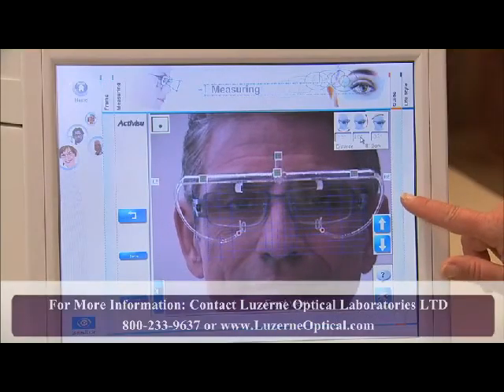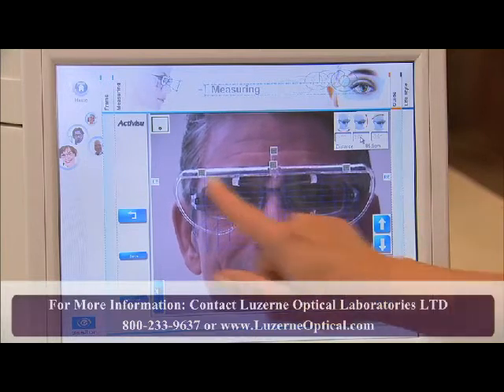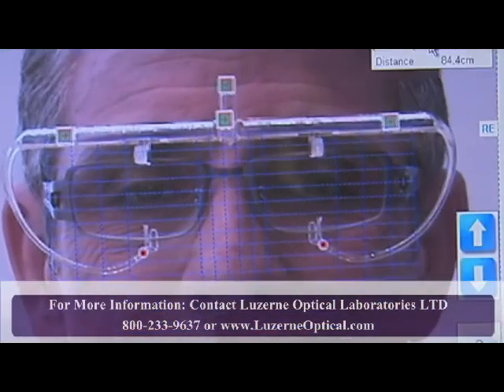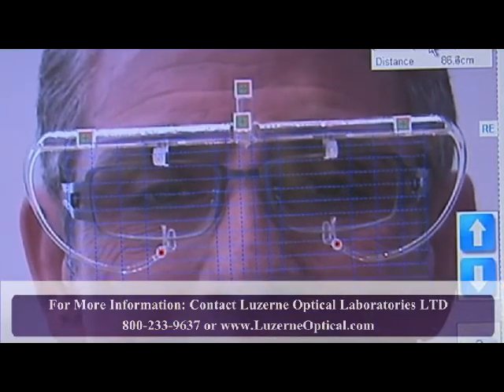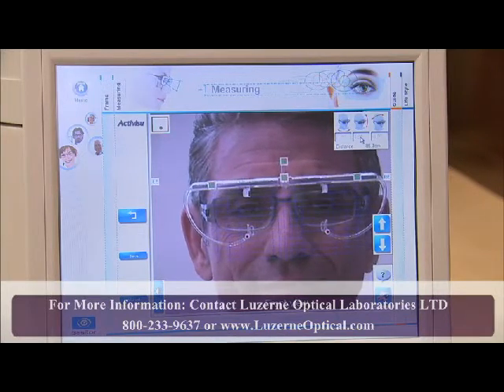You can raise or lower the camera using the arrow buttons on the right side of the screen. A good rule of thumb is to align the crossbar of the clip with the LE and RE icons on the screen. A grid will appear on the screen over the patient's face, confirming the VisiOffice system is reading all the sensors. It is important that all the sensors are uncovered, so have the patient move his or her hair out of the way if necessary.